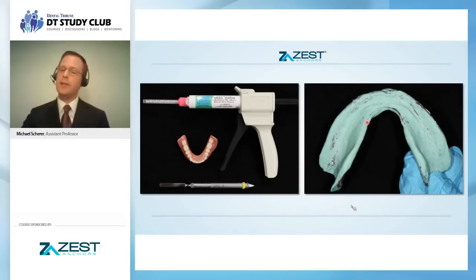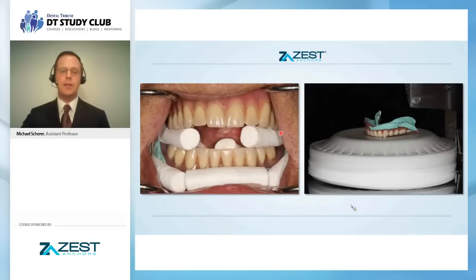What we've been doing lately is reline procedures in the patient's existing complete denture. The key is to border mold just like you would for a reline. Again, using that soft tissue separation method, we're going to scan with that radiodense PVS material in the patient's mouth with soft tissue separation, and then do a subsequent scan of the patient's denture only.